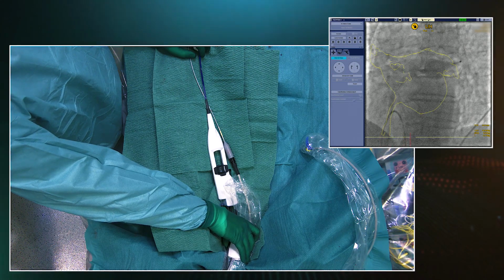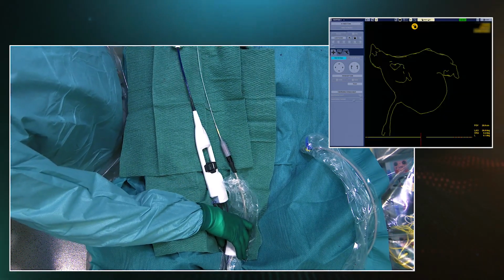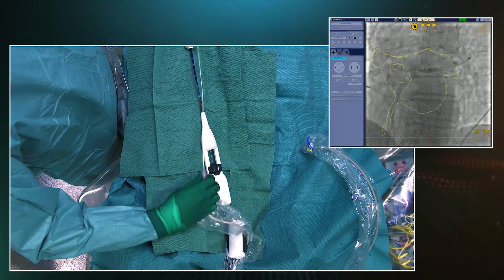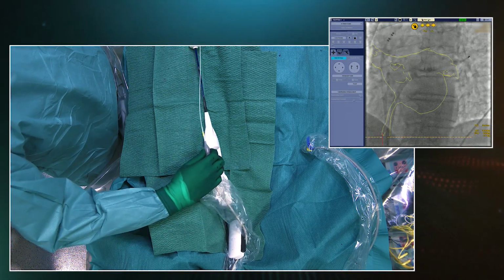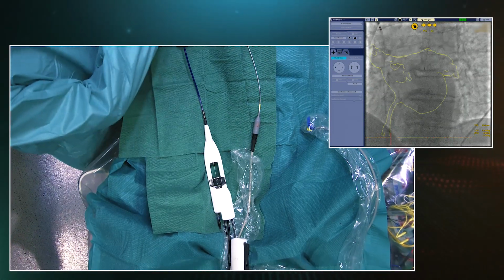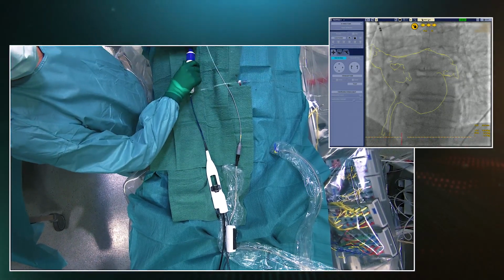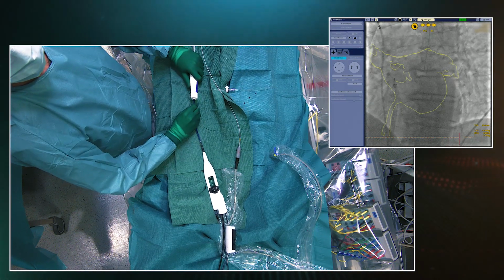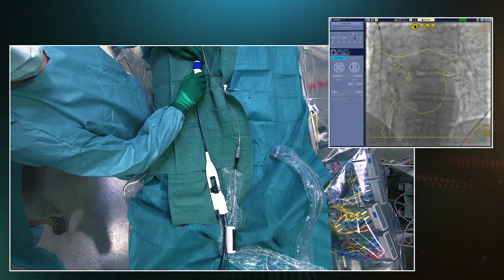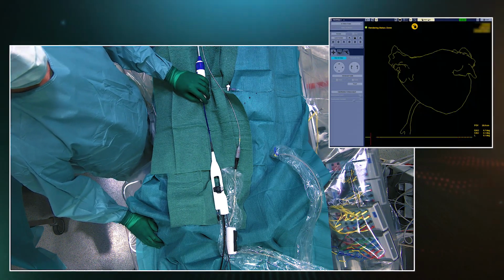So we can move to the right. For the right side, we'll need to prepare phrenic nerve pacing, of course, as always. Putting back the catheter into the sheath, and now I'm rotating, opening the curve so as not to be traumatic, of course, and now pointing to the right side. I'm going to give it a little bit of curve. And then again, let the catheter do the work, let the catheter find its way into the RSPV.